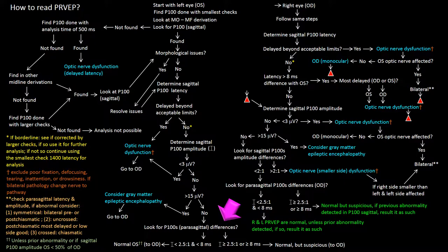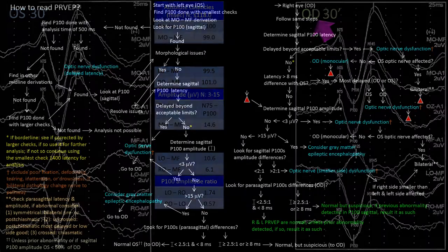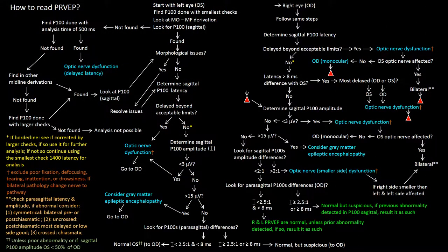After evaluation of the parasagittal P100s, we conclude that the left eye study is normal, as the left P100 sagittal is not less than 50% of the right P100 sagittal. The next step in the flowchart is to go to the right eye, so we go back to the panels. We start again, but this time with the right eye, indicated by the letters OD. We follow the same steps as we did for the left eye.